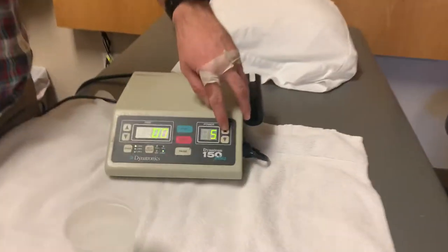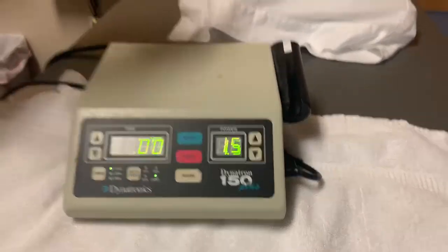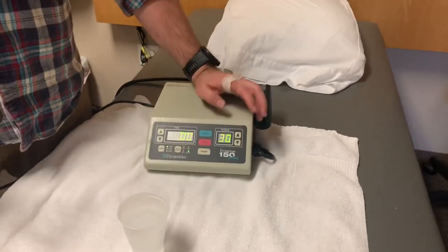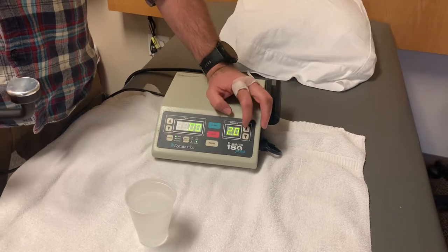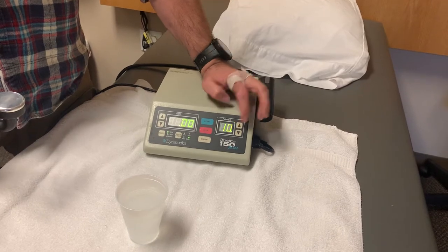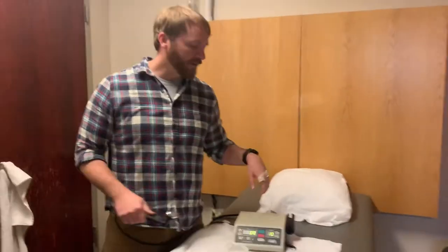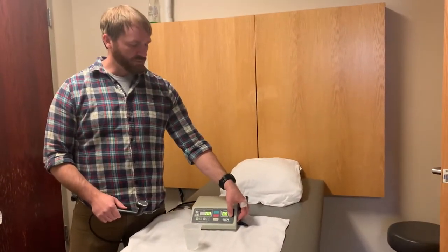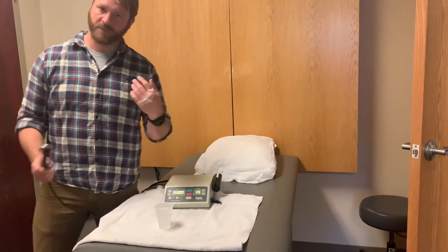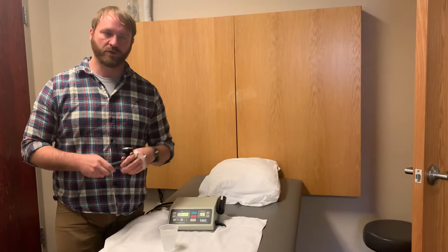So if you're doing an intensity of 1.5, if you're going for the same effect underwater you're going to increase that to 2.0. Most machines go up to about 2.5 as the highest you're ever really going to use. Once you get up to 10 — and these machines do go up to 10 — that's where you can actually start getting some tissue damage, so you want to stay away from that. For the most part most people are going to range between 0.5 and 2.5.